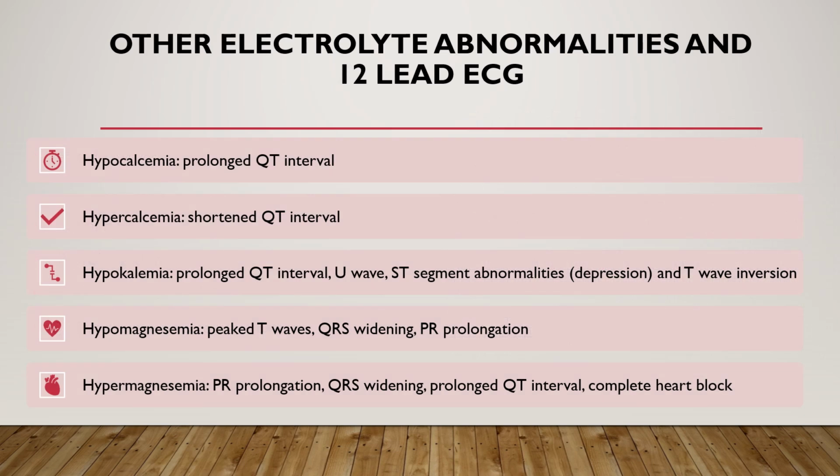So what about other electrolyte abnormalities and patterns on the 12-lead EKG? Here some of the most common patterns are presented. Please take a second to review this slide. This is sometimes tested on ABA exams.